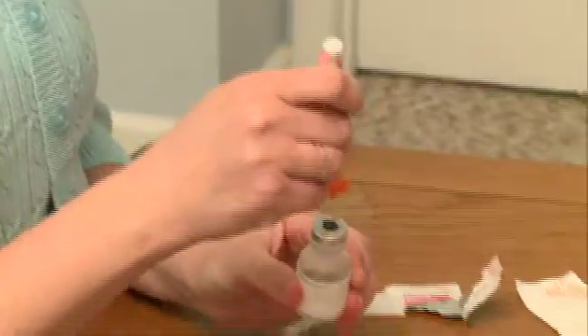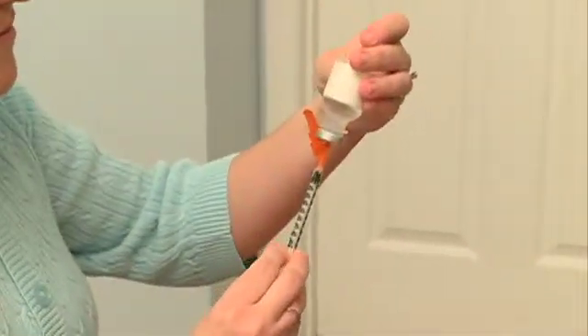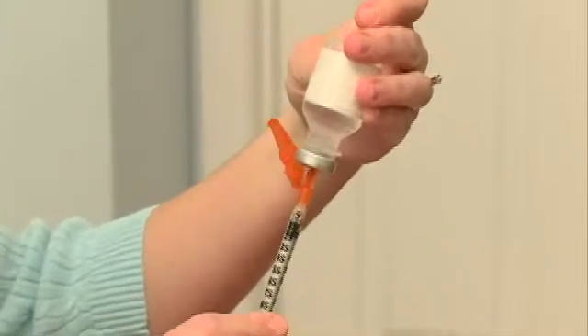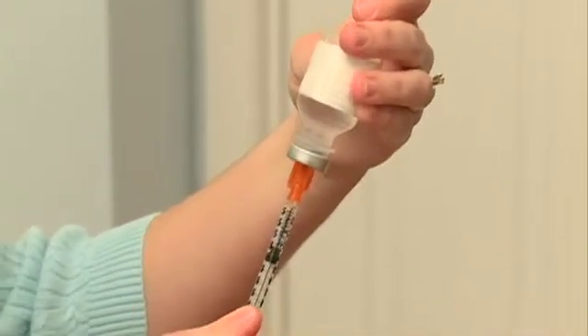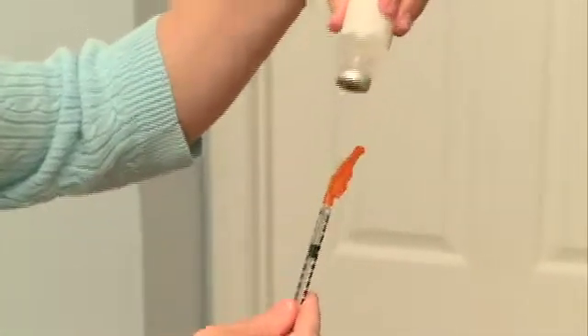Stick the needle into the center of the medication vial and inject the air into the vial. Pull back the syringe so the medication flows from the vial into the syringe. Once the right amount of medicine is in the syringe, remove the needle from the vial.